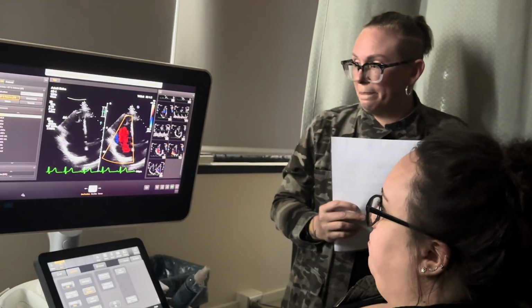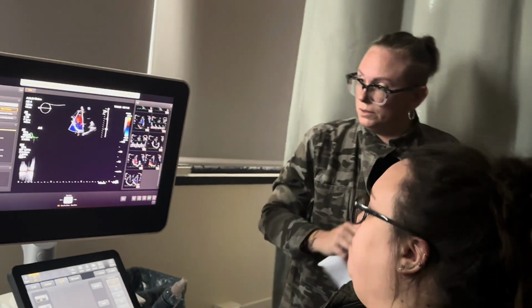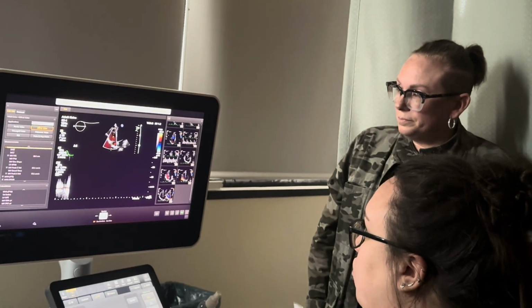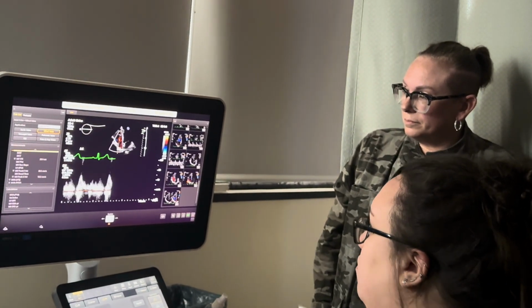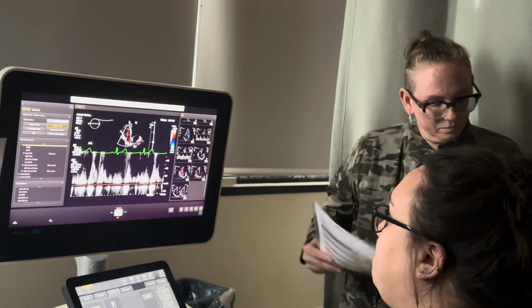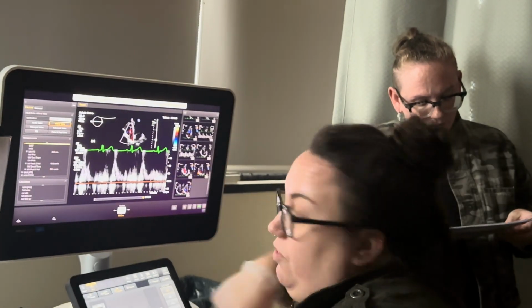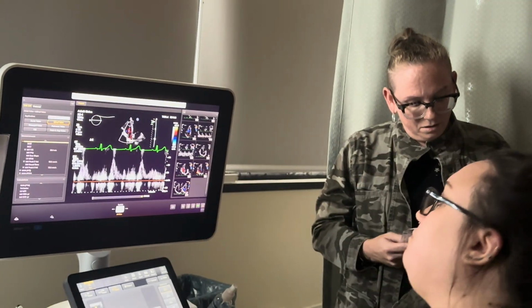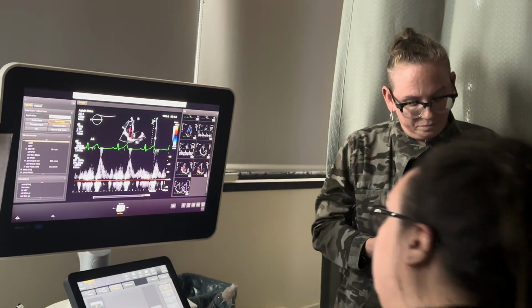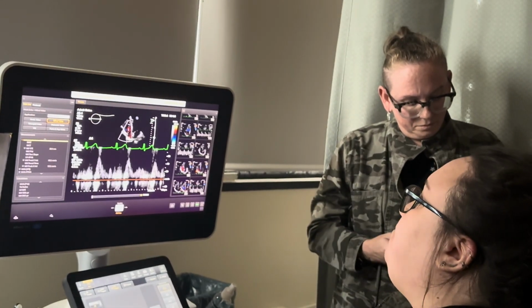What am I getting here? You're getting continuous and pulse. Okay, same thing. Put that pulse wave sample volume right as those leaflets are opening, right in between them. You don't have to measure anything on that. That's your TR coming through. So, not measuring, but we still have a nice little M. Both of our AV valves will have a little M as their inflow.